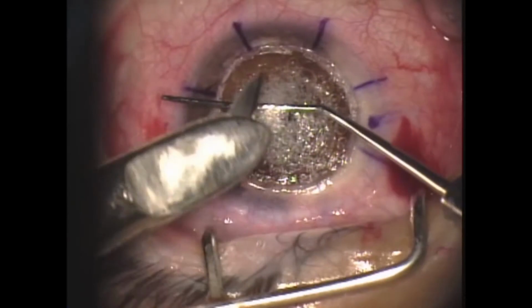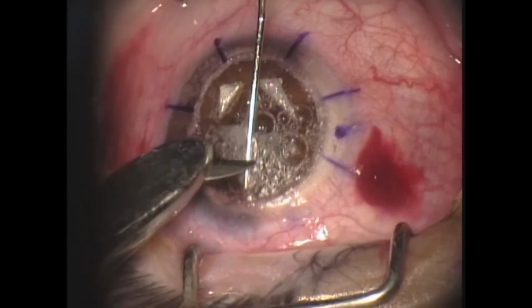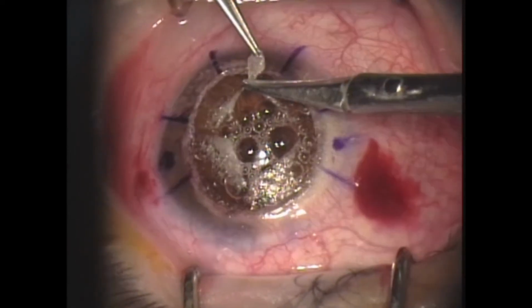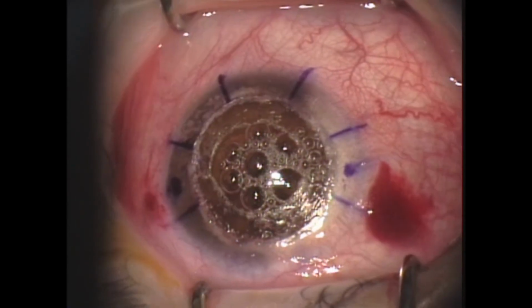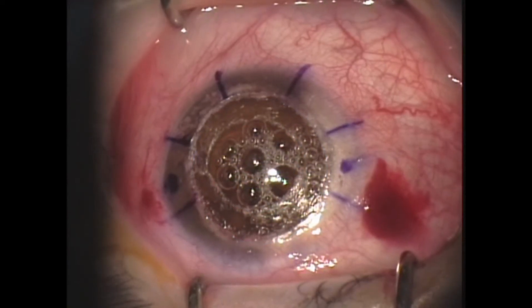It was decided to dissect the rest of the stroma. Because of the greater fragility of the tissue due to the big bubble type 2, it's preferred to dissect just 4 to 5 central millimeters. Dissecting more tissue to the periphery may result in higher chances of a perforation.